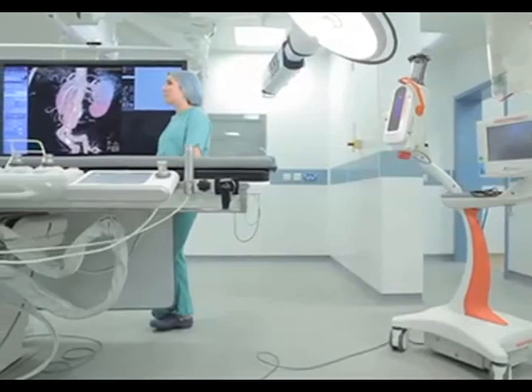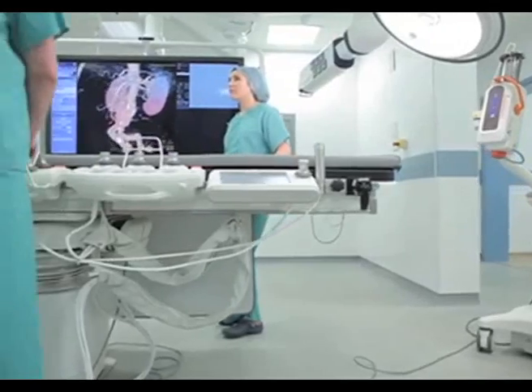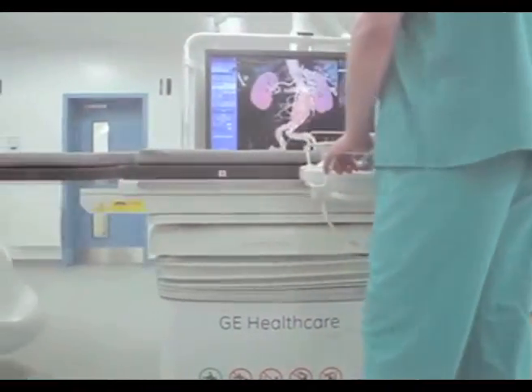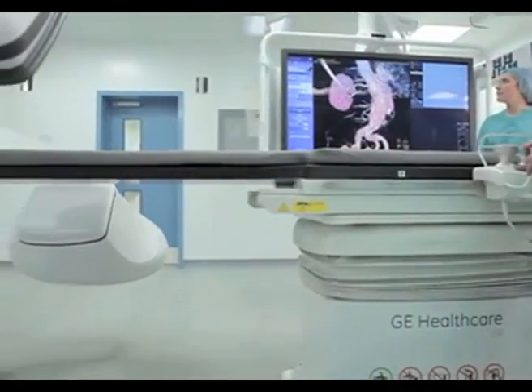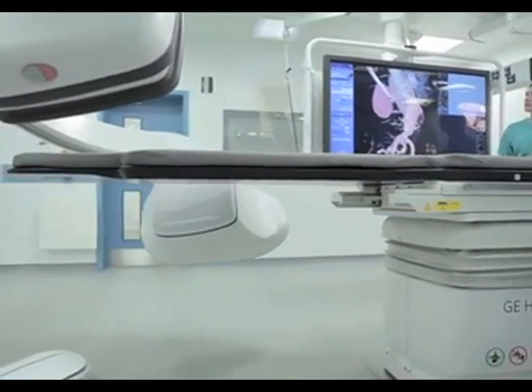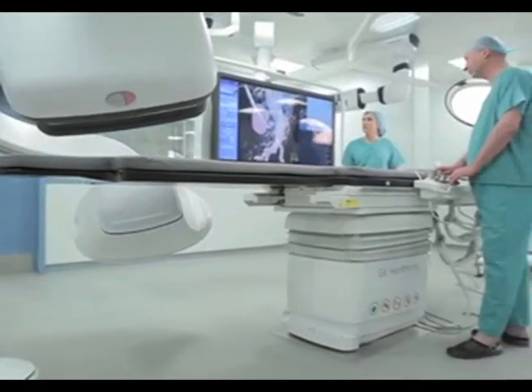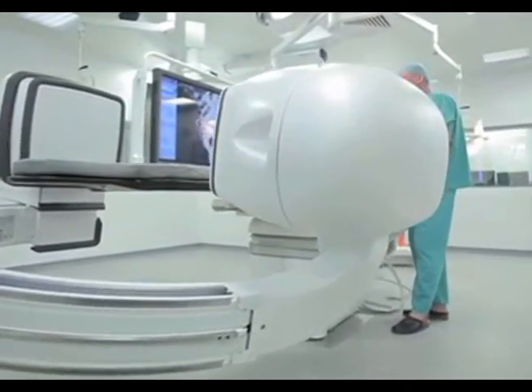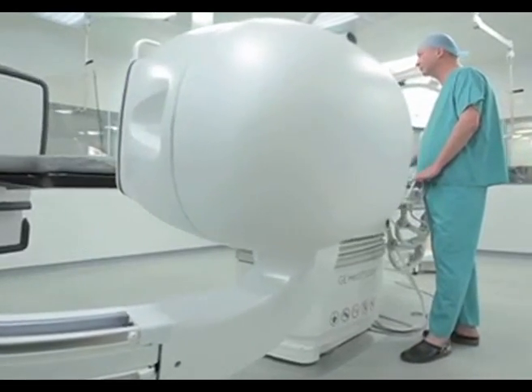At the same time as the introduction of fixed systems, there was a transition between analog and digital imaging technology. This makes it possible to have a much smaller system, lighter system, or mobile system, and these systems can be used now to acquire CT-like images in the operating theatre and also three-dimensional angiography.